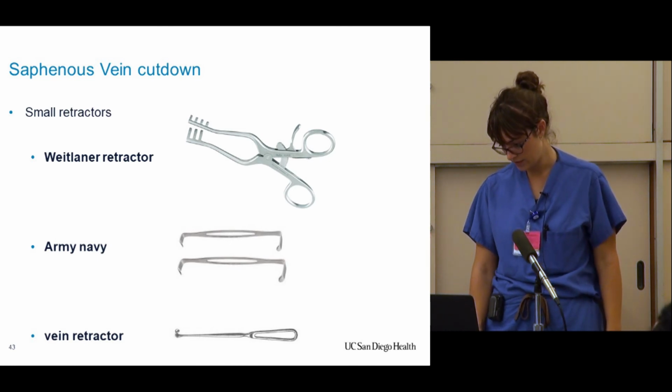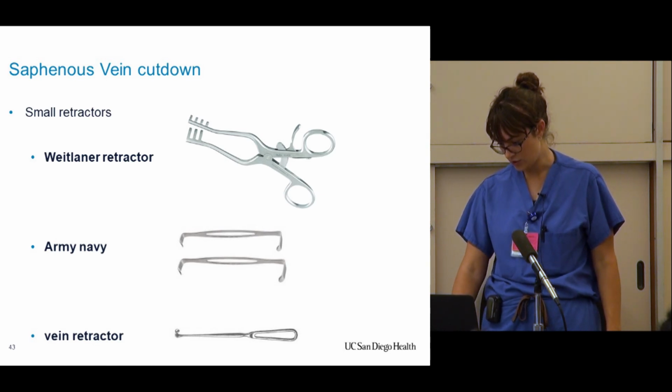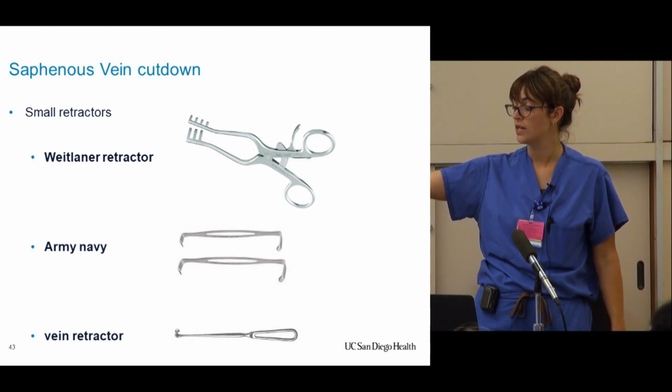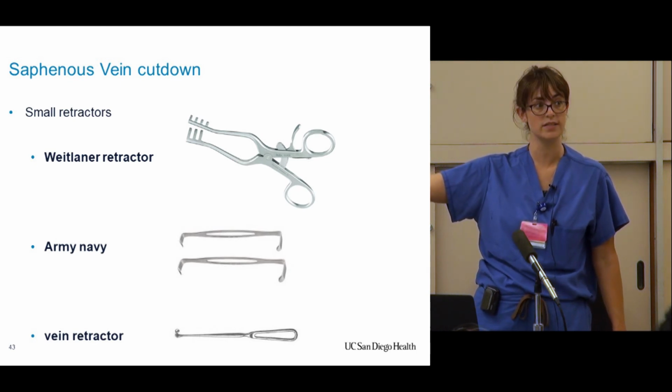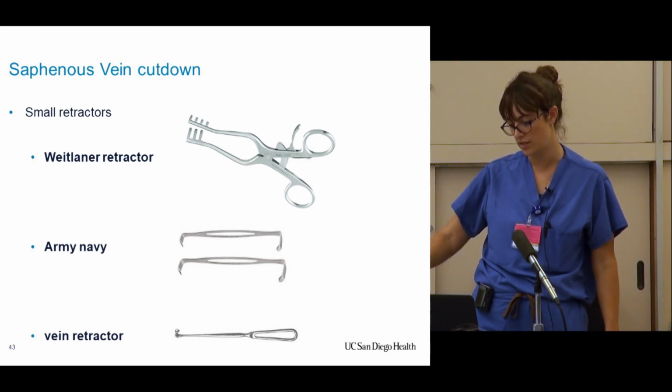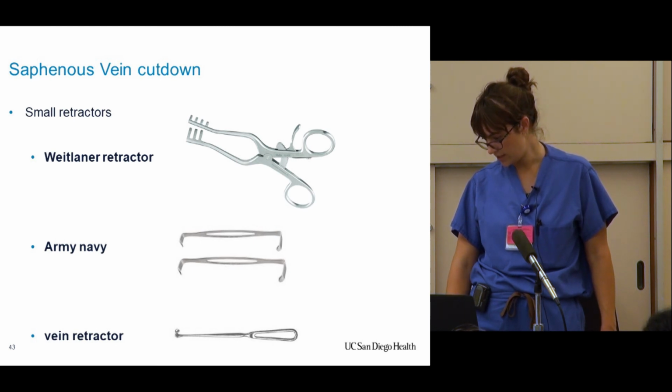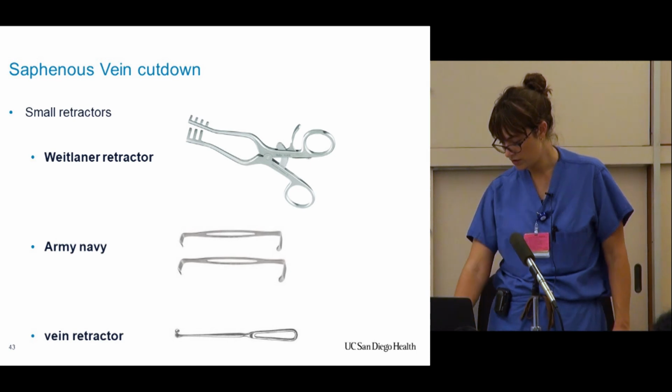Okay. Knife and tube. And some suction, really good. And the retractors, just the resus tray at the side of the bed that has all the retraction that you need. There's also the dilator. So that's where the cric tray lives. There is one in there.